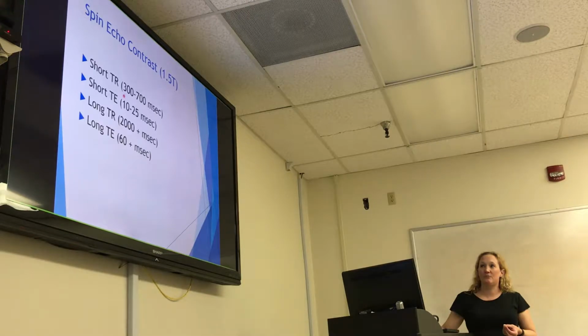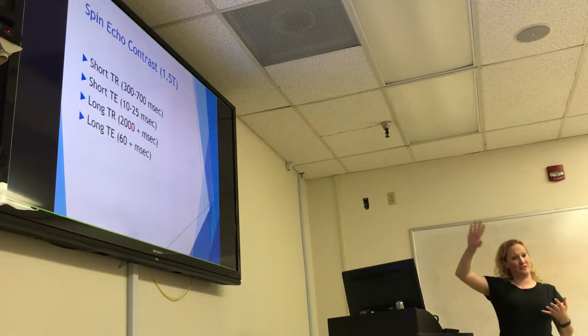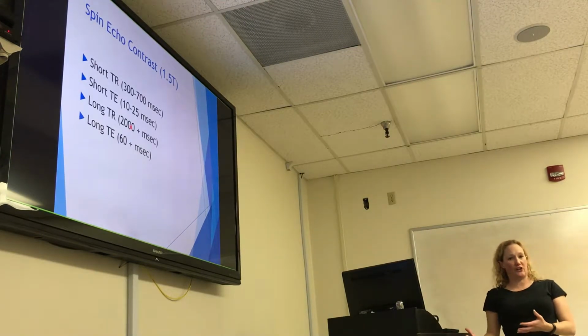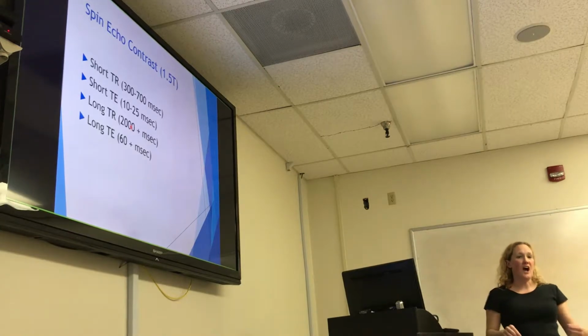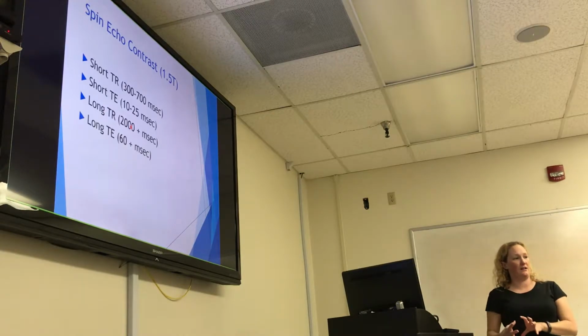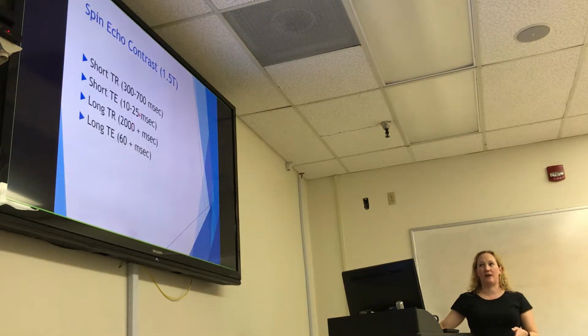And then short TE would be in the range of 10 to 25 milliseconds. So again, you can see that these are not apples to apples. This is apples to oranges as far as short and long go. But you do need to start paying attention to and remembering these parameters, because if you have to add slices or make changes to other parameters and it pushes these beyond those limits, you're not going to be getting the weighting that you ideally want. You're going to be changing the weighting of your images, and you don't want to do that for optimal diagnosis. So you do need to start paying attention to those ranges when you're scanning.